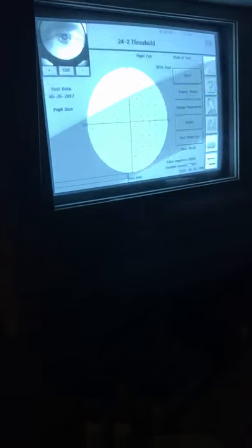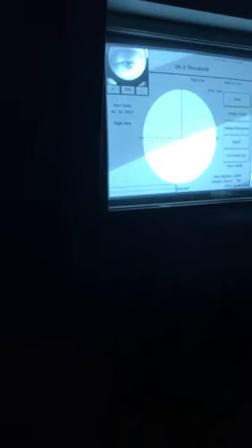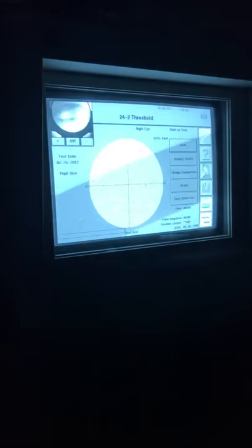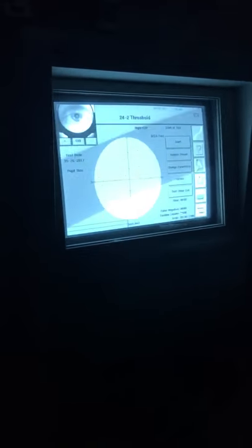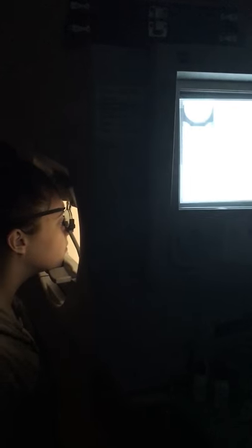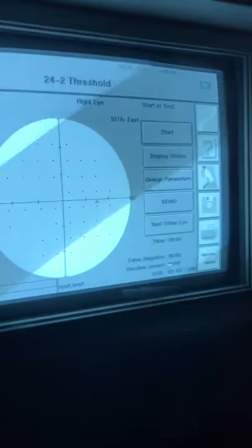Before we start, I always tell them the instructions. They'll be looking at an orange light in the background, which is their fixation light. During the test, they'll be seeing some small white flashing dots all around in the perimeter of the machine. Some lights are very bright, some are very dim. Whenever they're sure that they're seeing those lights, they're going to click that button.